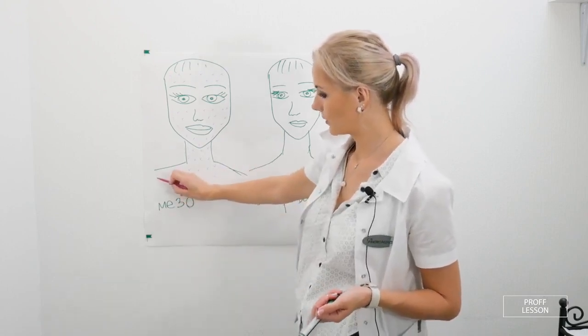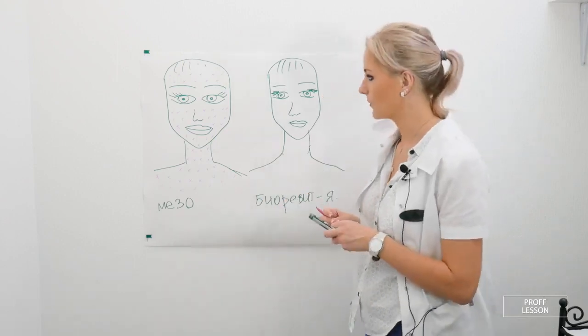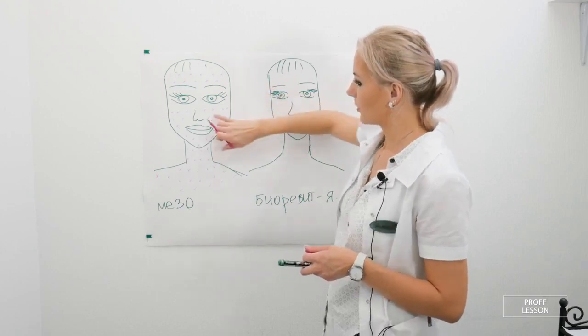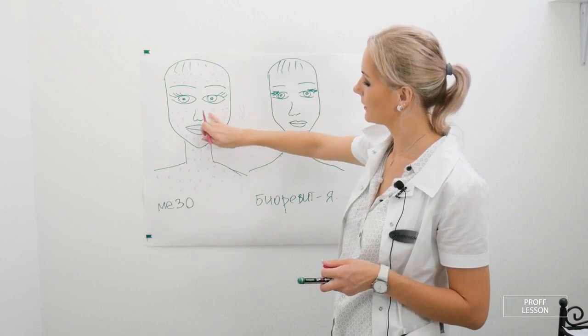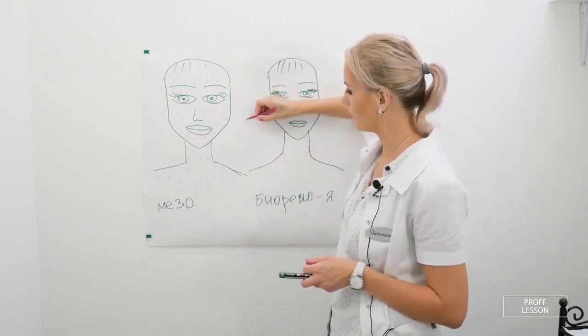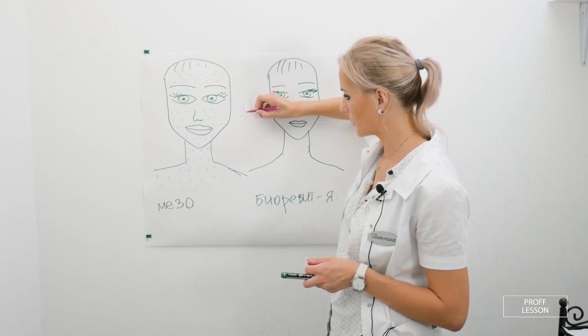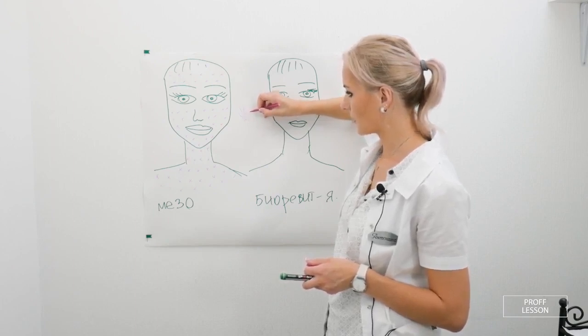Mesotherapy on the face is done for the purpose of vitaminization. If we have some kind of vascular network, for example, around the nose or on the cheeks where we often have couperose, we inject papules around these networks. There are about 5 to 7 millimeters between the papules.